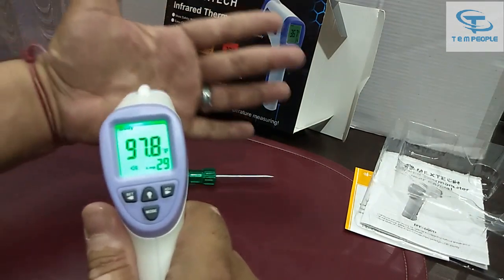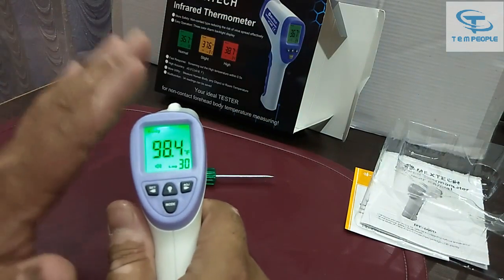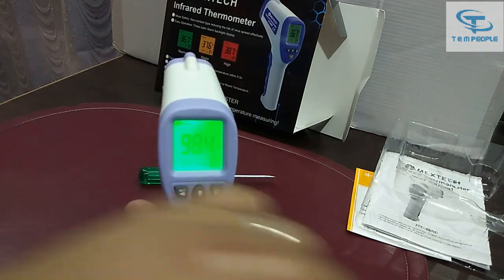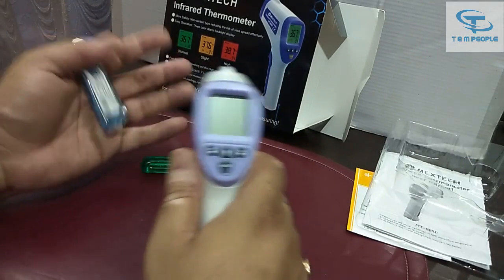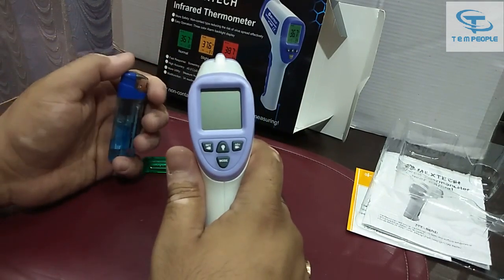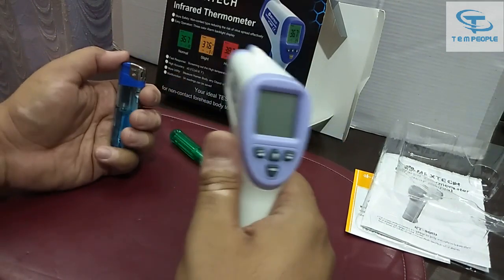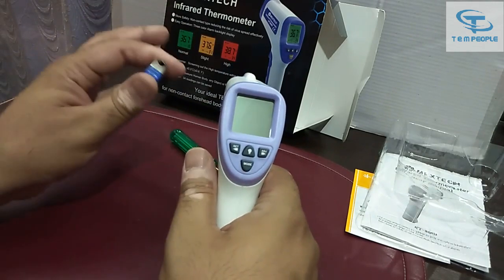Now testing on one of my subjects — the reading is 98.4°F, showing a green color, which means it's normal. None of my subjects currently have a low or high fever, so to demonstrate the color change I'll use a lighter to simulate a high temperature.